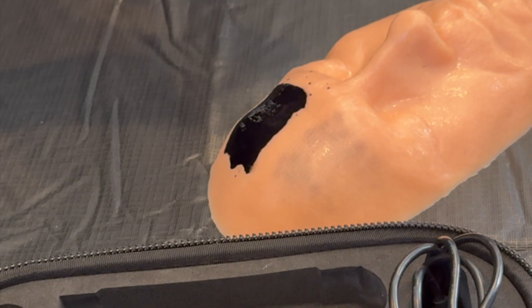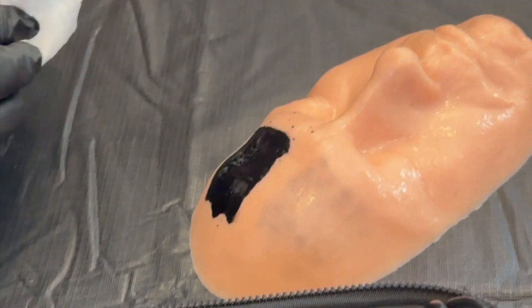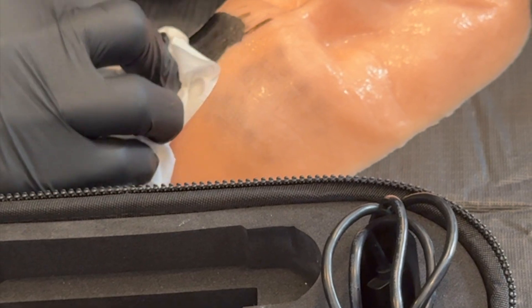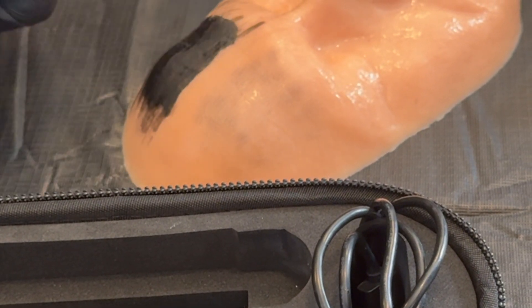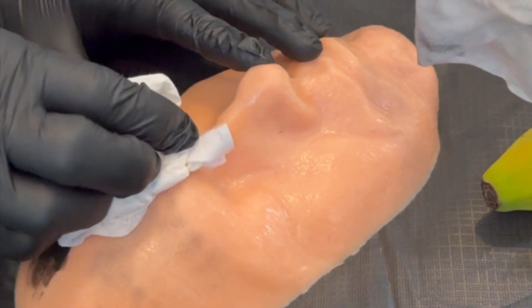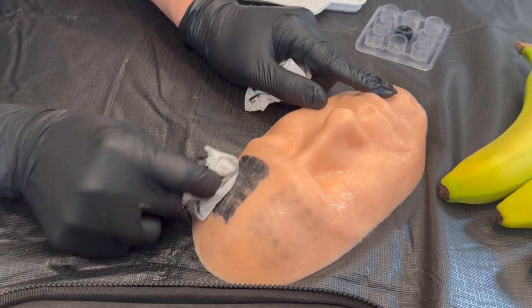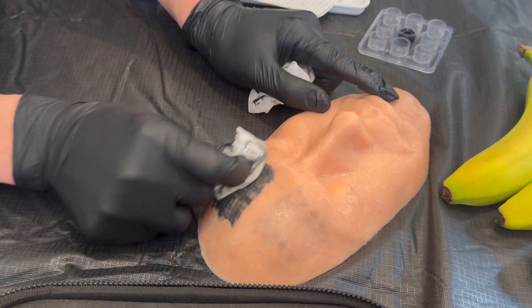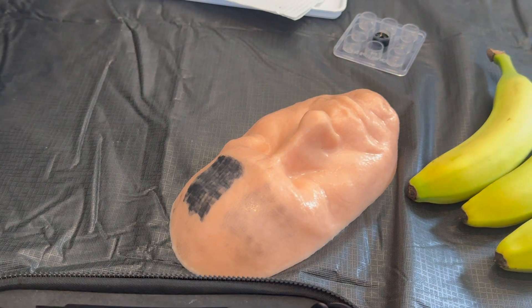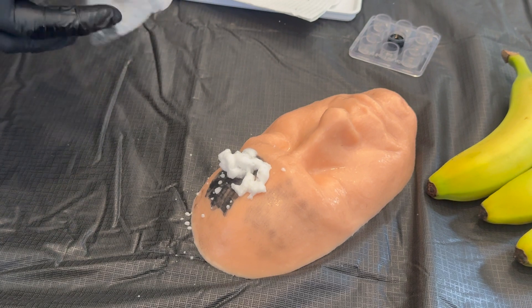How do I turn it off? Just push it? Now wipe it off. Do exactly the same wiping. Oh, you really tattooed him! Now you can use this one. Can I get some soap? Yeah. Let's do the same — can we get more makeup remover? Soap. Let's rub super well, like the other side.